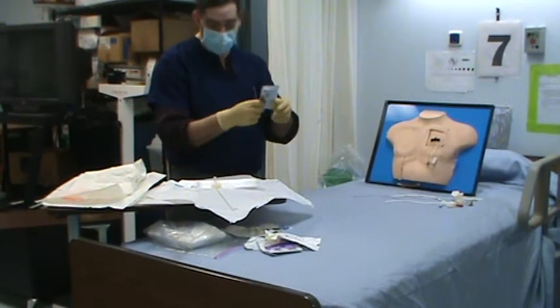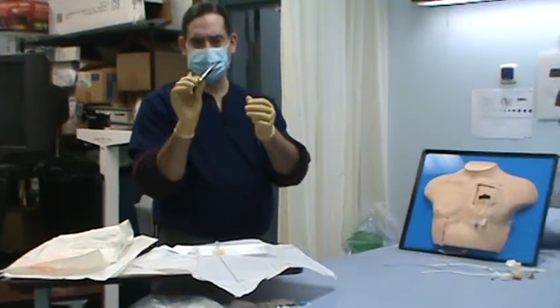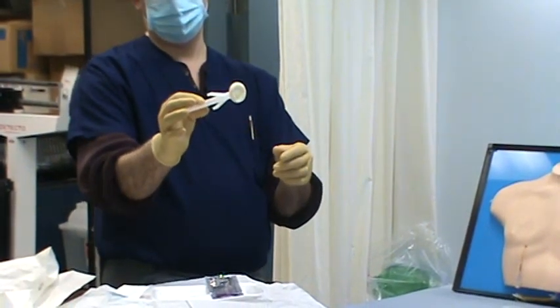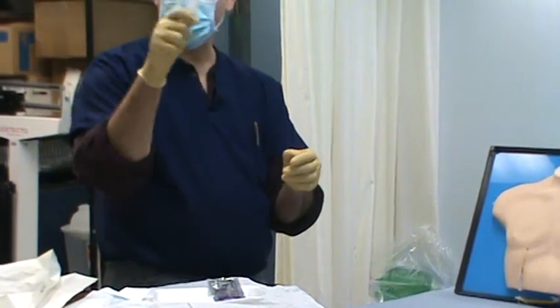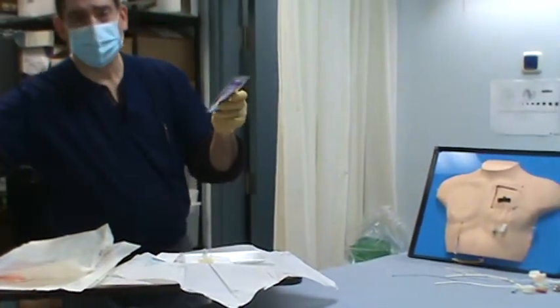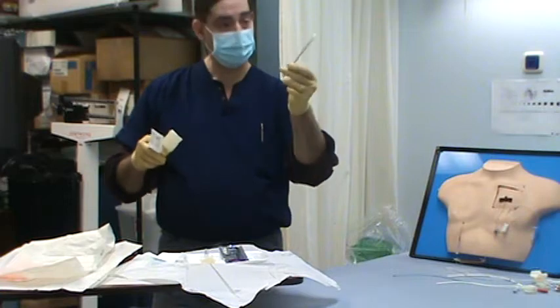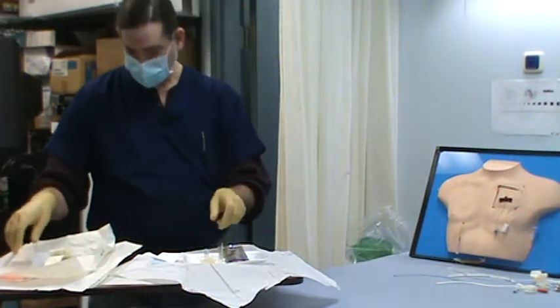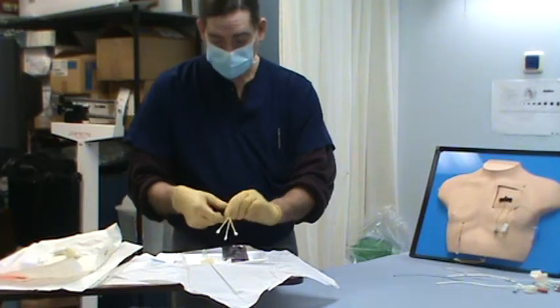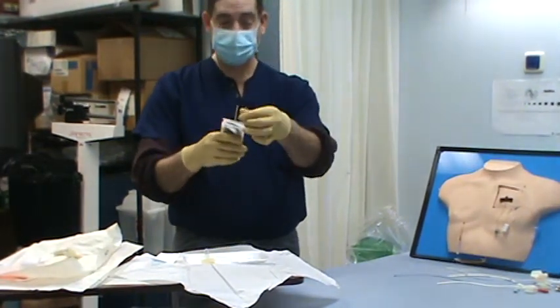Now we have several different types of things here. These are little alcohol sticks. They're like Q-tips. I need some Q-tips to simulate these. And this is a big ChlorPrep, and a lot of times we'll use this too. So luckily it's the sim lab. Now I'm not going to rip this open, because it's a big mess if you do. But I'm going to simulate it with these little Q-tips. So there's 3 of those, so I have 3 of my Q-tips here. We're ready to go. So I would rip this open. And the pack's sterile, it's in my sterile kit, so I can just pick it up.